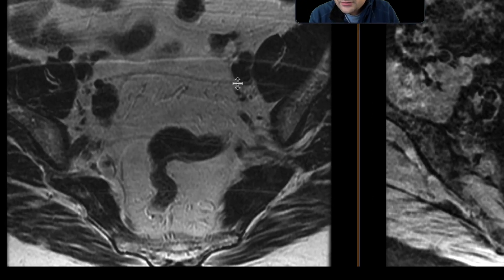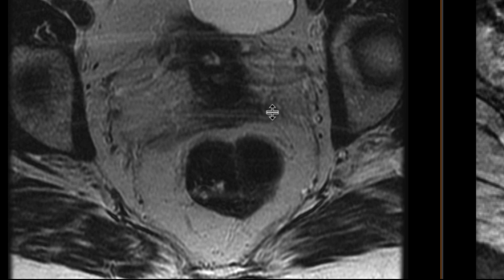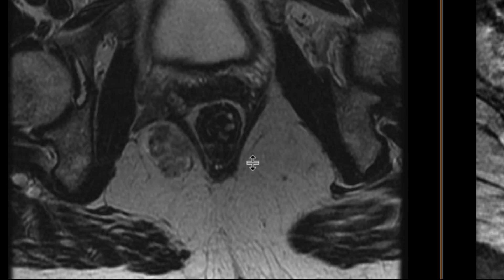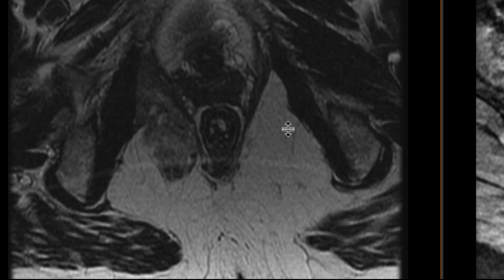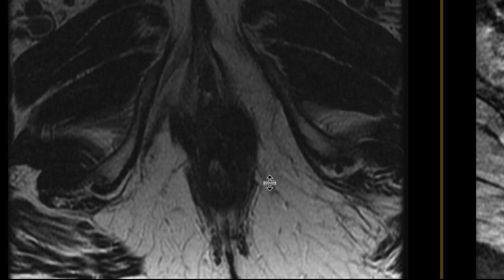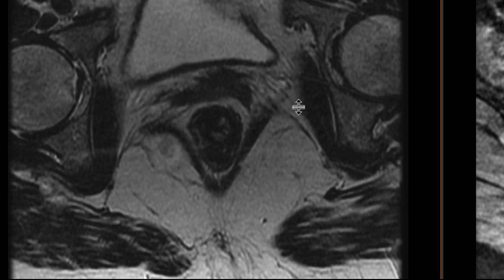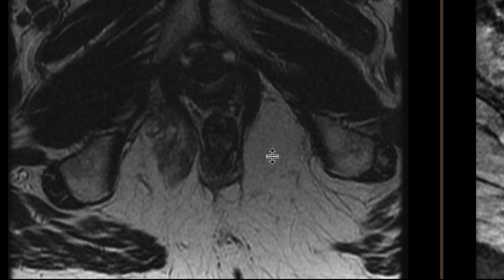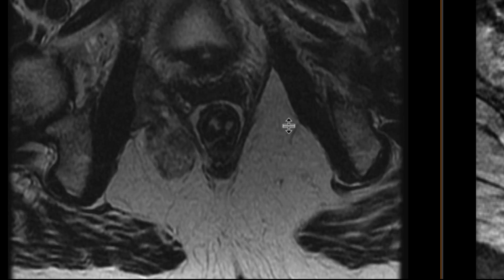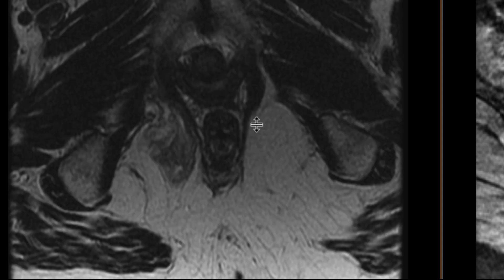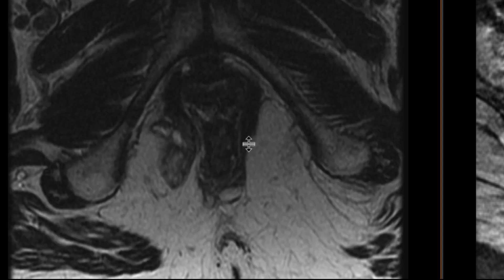Here we have a T2 weighted image done without fat saturation. As we scroll downwards, we can see that there's an abnormality down in the pelvis, specifically centered in the right ischioanal and ischiorectal fat pad. It has sort of intermediate T2 signal, some areas of rather darker T2 signal, and some areas that are slightly brighter.